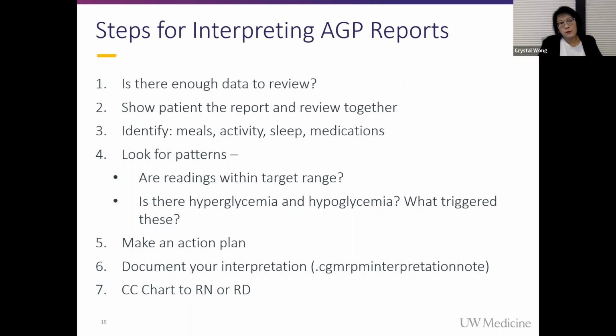I think though, the real benefit you're getting from CGM is the improved conversation with the patients about diabetic control and interventions. That's where I think the major benefit is, sitting down with the patient and looking at the report together. So I would say that's the best practice. It's not essential for hitting the billing requirements, but you get a lot of good conversations out of it. You're going to look at that curve and identify, when do you eat, when do you exercise, when do you sleep, when are you at work, did you travel? All those things that go into what is causing the glucose fluctuations.